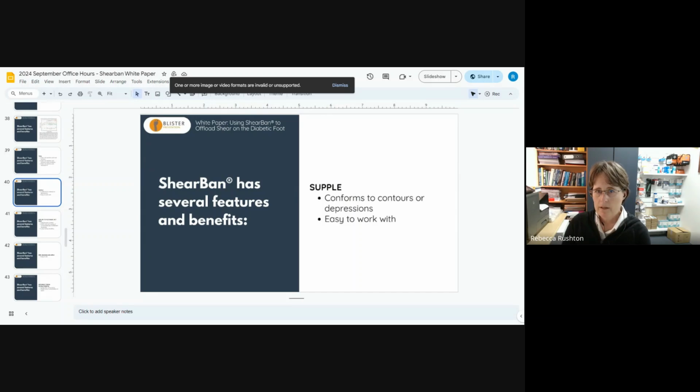Where there is significant pressure deflection, I like to make the patch quite a bit bigger than it really needs to be, because as the patch is pushed down by the prominent joint, let's say a metatarsal head, it kind of puckers the patch around the outside. And I don't really want that puckering to be anywhere near an at-risk area. That's the only thing I find.